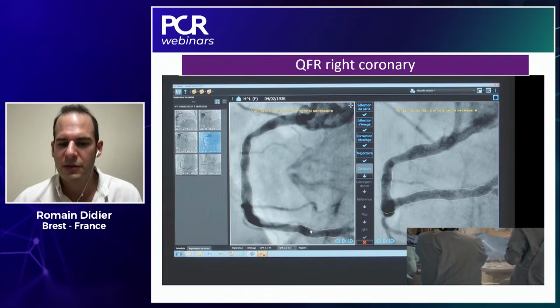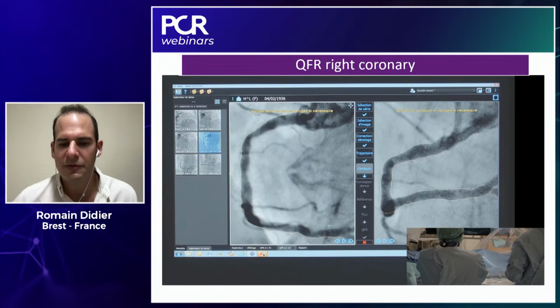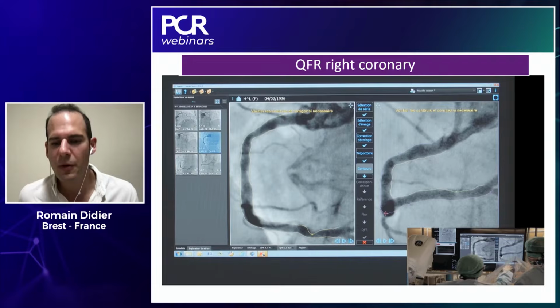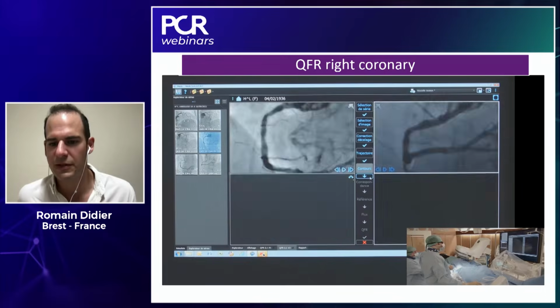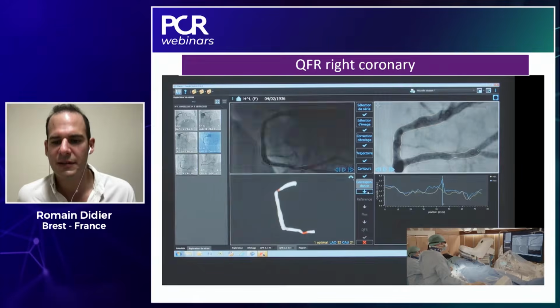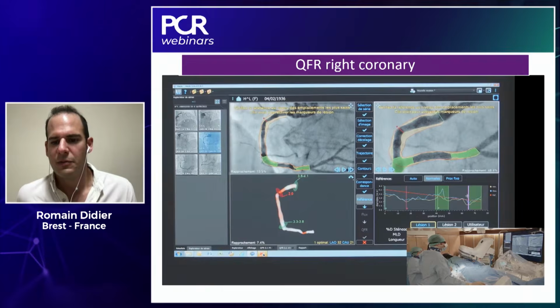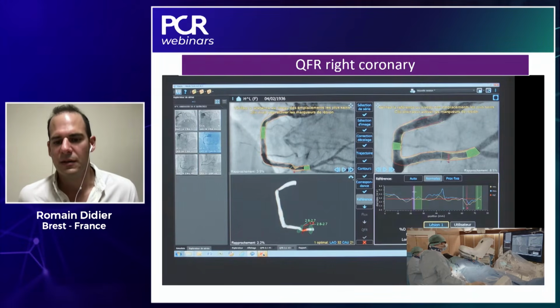So this is an important point you can look at, because at the beginning we were really thinking that this lesion is very tight and that we should treat. So we probably overcorrected too much in the two views. As you can see, we probably made too many corrections. And we find in red here a very tight stenosis, probably artificial. So we put the reference of the vessel as well, the distal part and the proximal part, that we say could be normal.